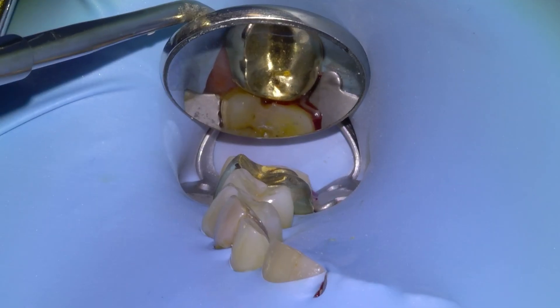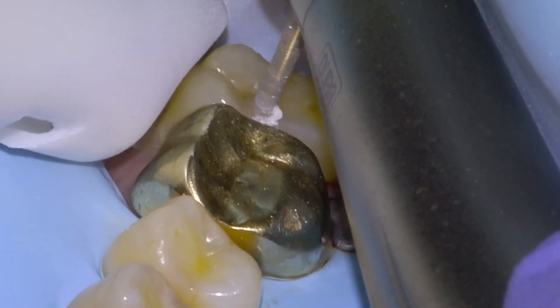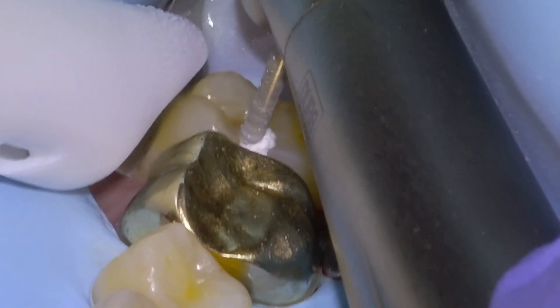So we'll anesthetize and get a rubber dam on. We would have frozen the buccal and the palatal. You can see that the rubber dam is resting directly on the palate because it wouldn't stay on the tooth.